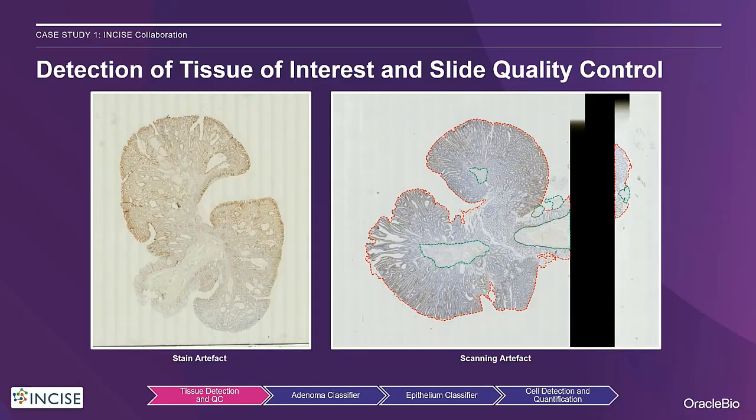So in terms of quality control, in a small-scale study with a few dozen images, checking every single image for large, obvious artifacts is something doable, but not here. When you are faced with thousands of samples, this initial screening needs to be robust and needs to pick up major artifacts that will impact any analysis further down the line.